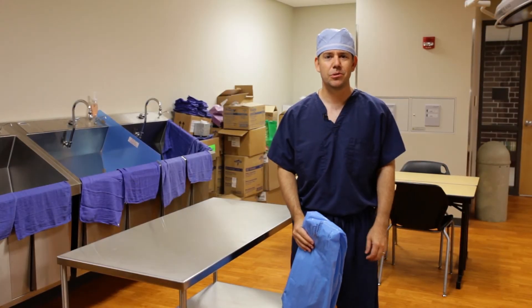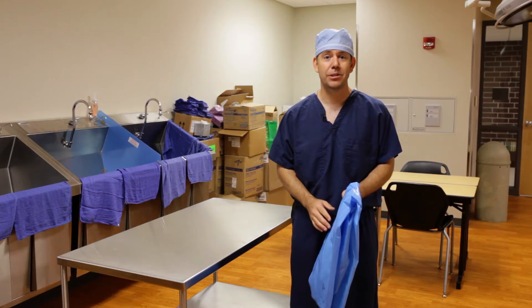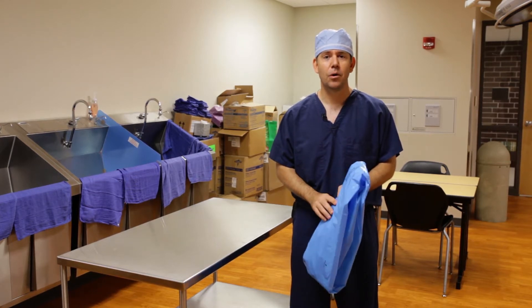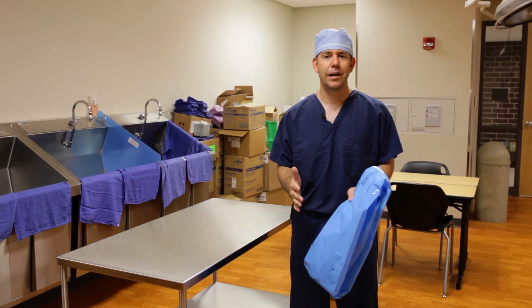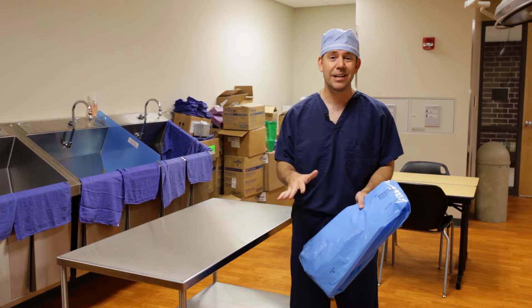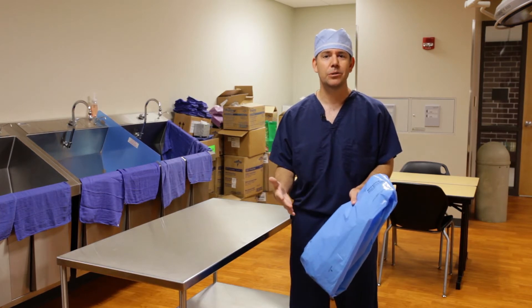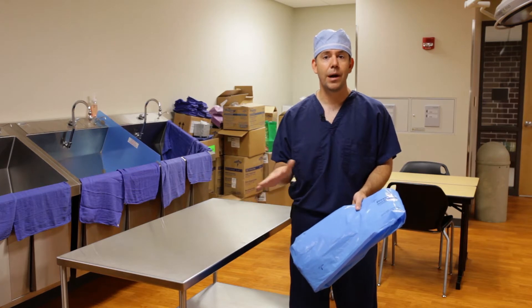Good morning surgical tech students. The next skill I want to show you is how to properly refold a Mayo stand cover. In the real world, we're never ever going to use a Mayo stand cover again in a clinical setting. But in the lab setting, we've got to constantly reuse our supplies, so it's very important to refold it like we're going to get it straight out of the pack.